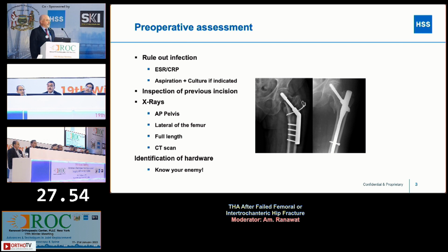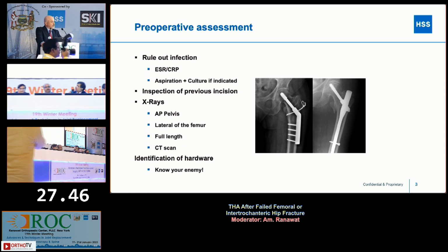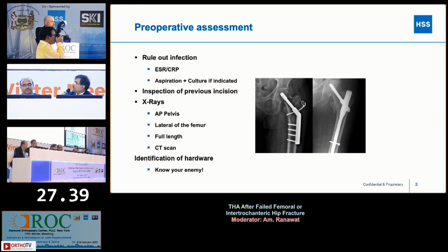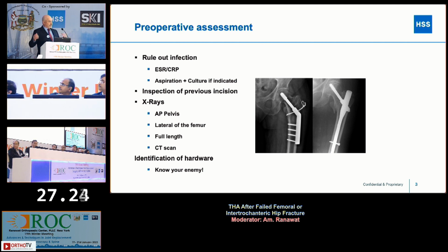Come on, guys. Anyway, Dr. Chatterjee. Yeah, I think it's very important to try and contact the center where the previous surgery was done to know about the implant, whether it's stainless steel or titanium, and what the company is, because one of the great difficulties you can face is trying to take out this implant. Absolutely. I think it's an excellent point, to do your homework and to know what the implants are, who makes them, to get the proper tools, because there's nothing more challenging sometimes than taking out hardware when you don't have the right tools.